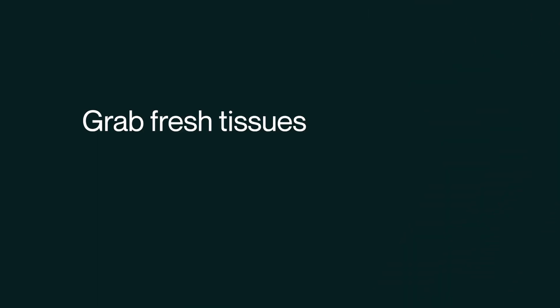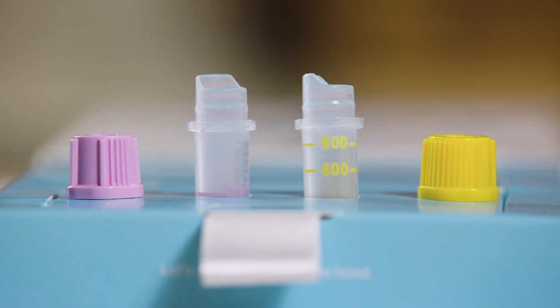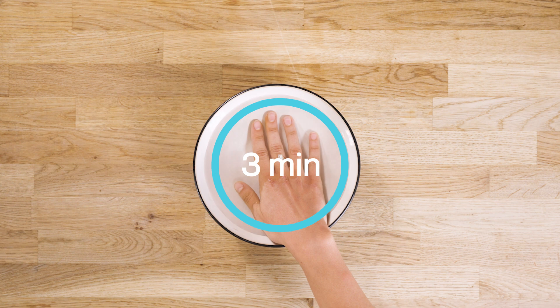Grab fresh tissues and a bowl of warm water before washing and drying your hands. Stand tubes in the holders and keep corresponding caps nearby if you have multiple tubes. Soak your hands in a bowl of warm water for around 3 minutes.